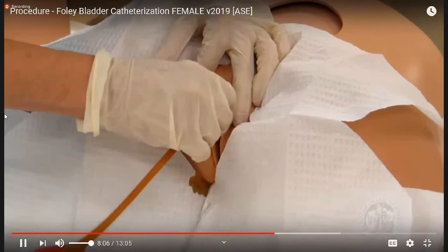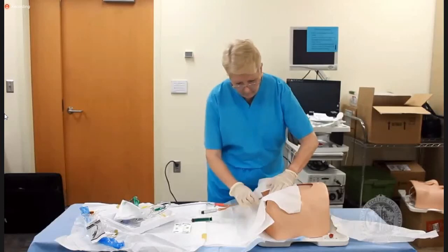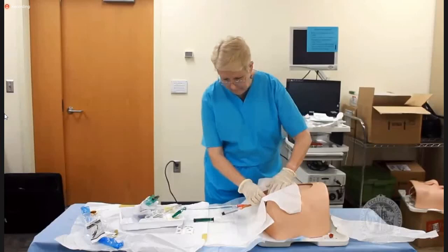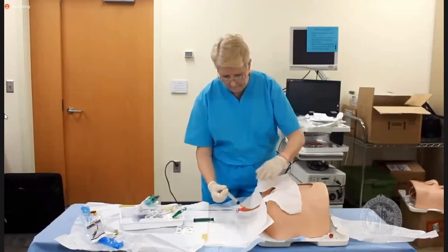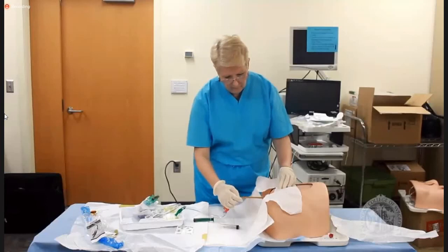When placing bladder catheters in patients with a vulva, advance the lubricated catheter until urine is seen in the tubing, and then advance another 2 to 5 centimeters before instilling saline into the balloon. Once at the correct depth, instill the correct volume of saline into the balloon and gently pull back on the catheter until resistance is met.